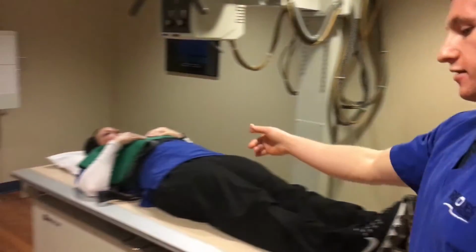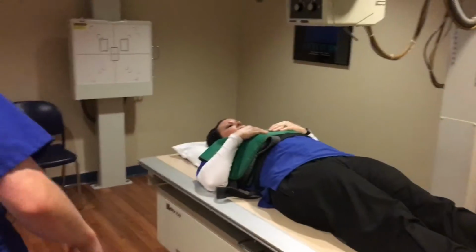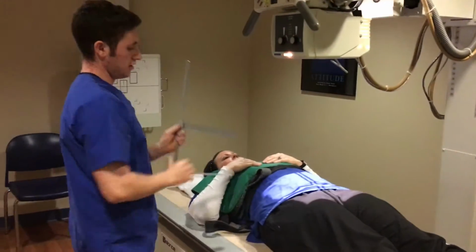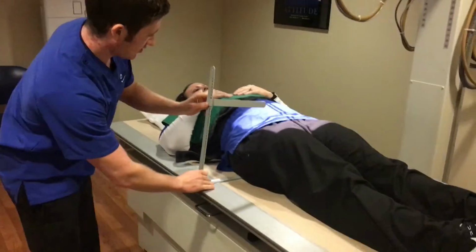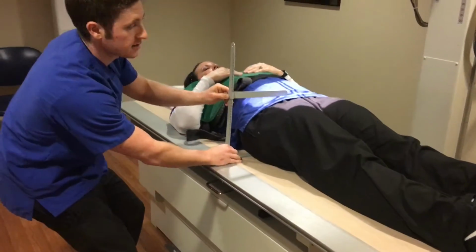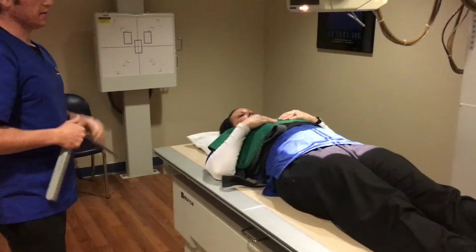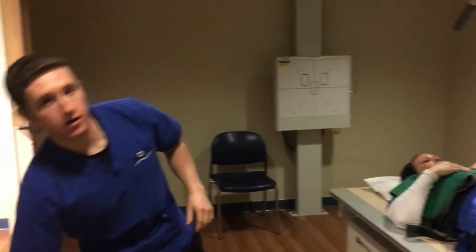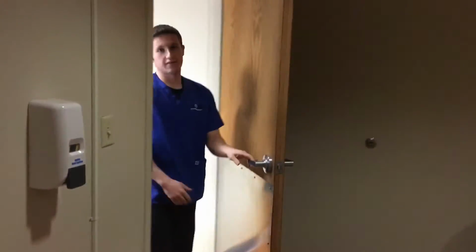I've got a shield across the chest here, mostly for psychological reasons, since the gonads are right in my area of interest. Once again, I'm going to measure through the path of my central ray here, and get 23 centimeters. I'm not going to collimate since she is an adult patient. If we had a child, we might be able to collimate a little bit. Now we're ready to go set my technique on the control panel. Once again, going to shut the door behind me on my way out.